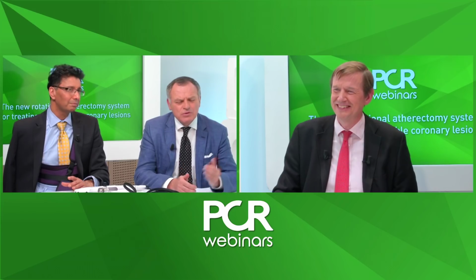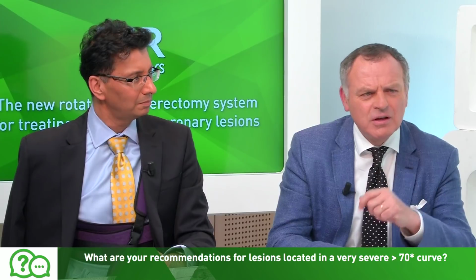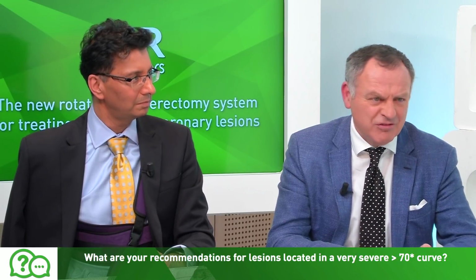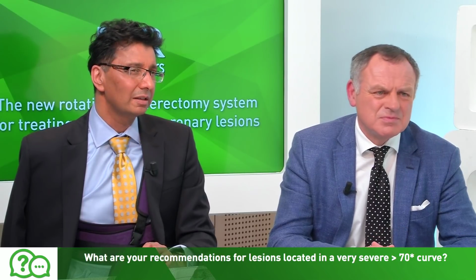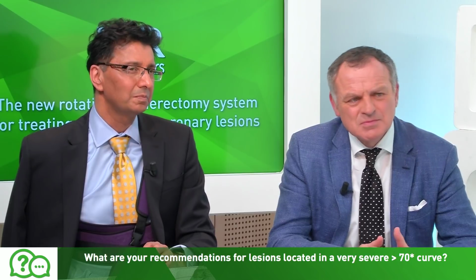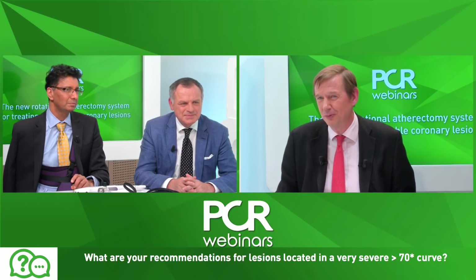Well, for a very tortuous angulation and a calcified angulation on the circumflex, I use normally a 1.25 millimeter burr. It's clearly the situation where you will downsize the burr. Okay, and you've not run into any problems as a result of getting stuck? It may be perhaps with the Guidezilla catheter giving you a bit more support round that bend with some of these modern techniques, which not a lot of us have got a great deal of experience about.